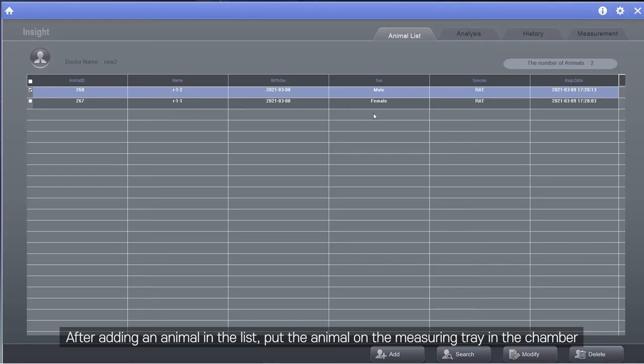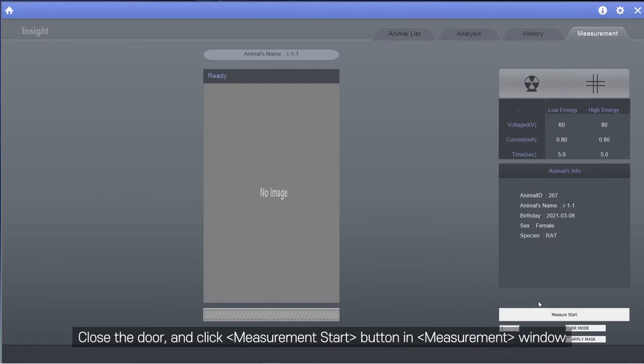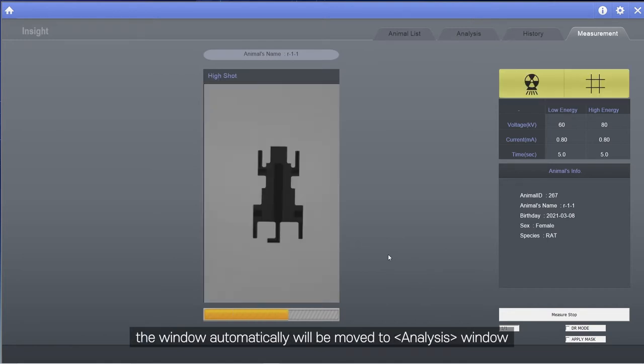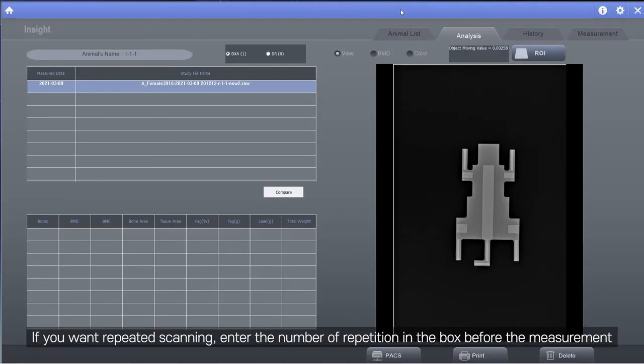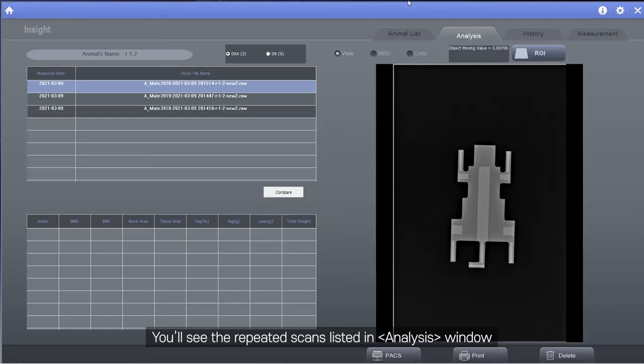After adding an animal in the list, put the animal on the measuring tray in the chamber. Close the door and click Measurement Start button. After 25 seconds, when the measurement is done, the window automatically will be moved to analysis window. If you want repeated scanning, enter the number of repetition in the box before the measurement. You'll see the repeated scans listed in analysis window.